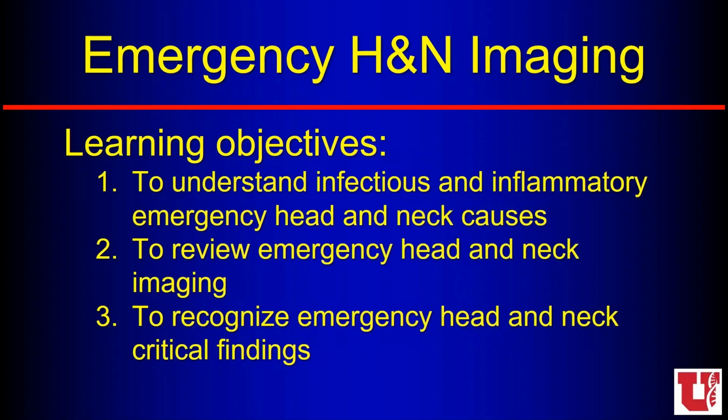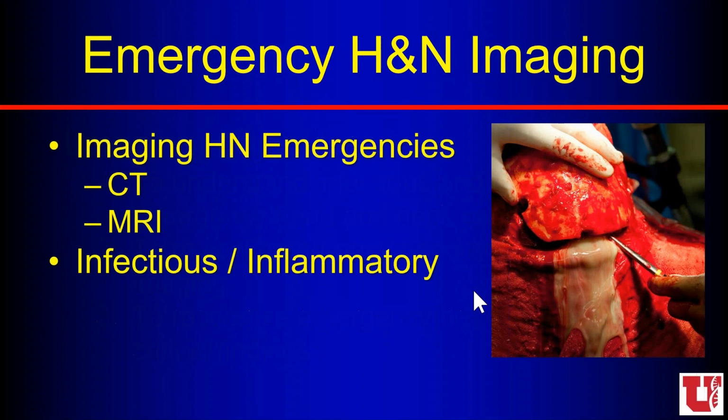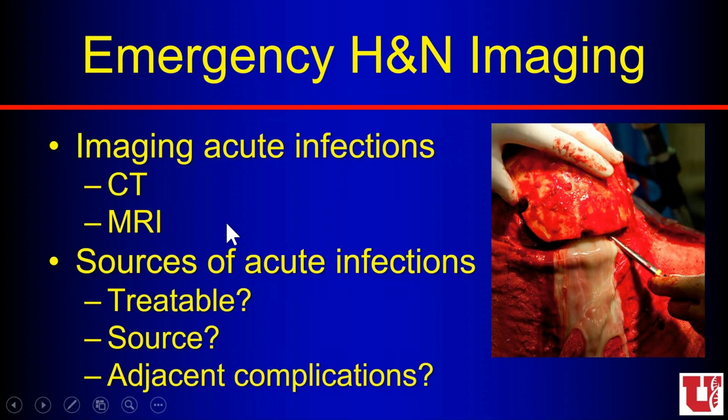Skull base infection and inflammatory is very different than dental disease, is very different than orbit, is very different than sinonasal, is very different than the extracranial head and neck. So we have very varied and different anatomy in all these areas. So again, CT and MRI is what we're predominantly using, and cross-sectional imaging in this world. So we'll talk about these modalities and how we use them in the head and neck.